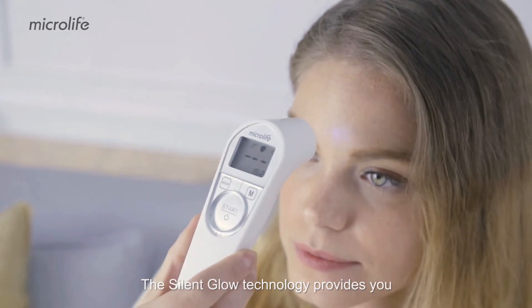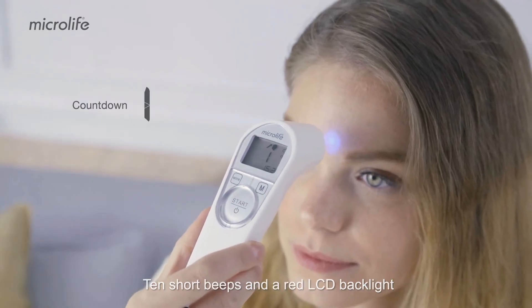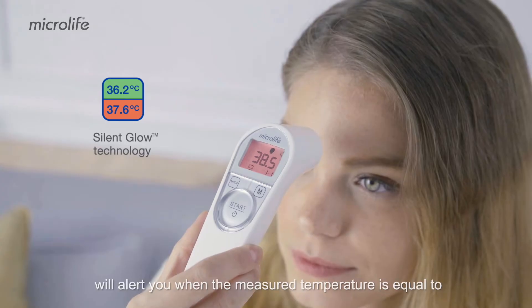The Silent Glow technology provides you with direct information about the measured result. Ten short beeps and a red LCD backlight will alert you when the measured temperature is equal to or higher than 37.5 degrees Celsius.